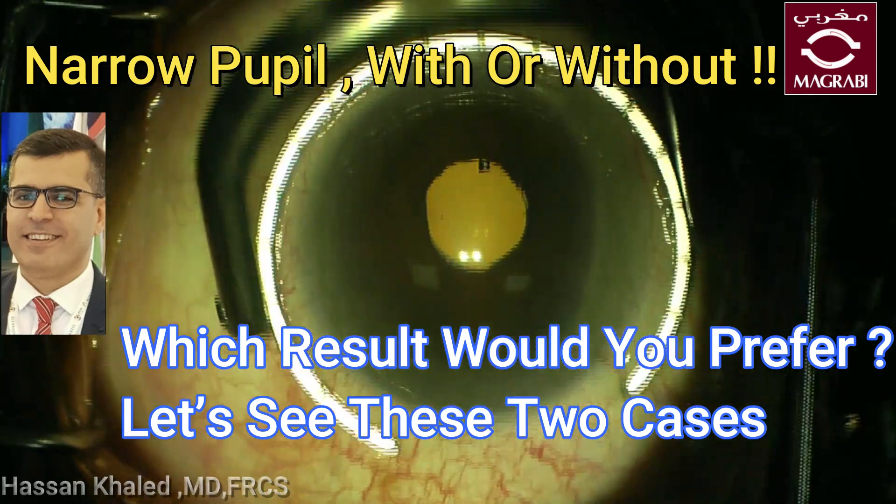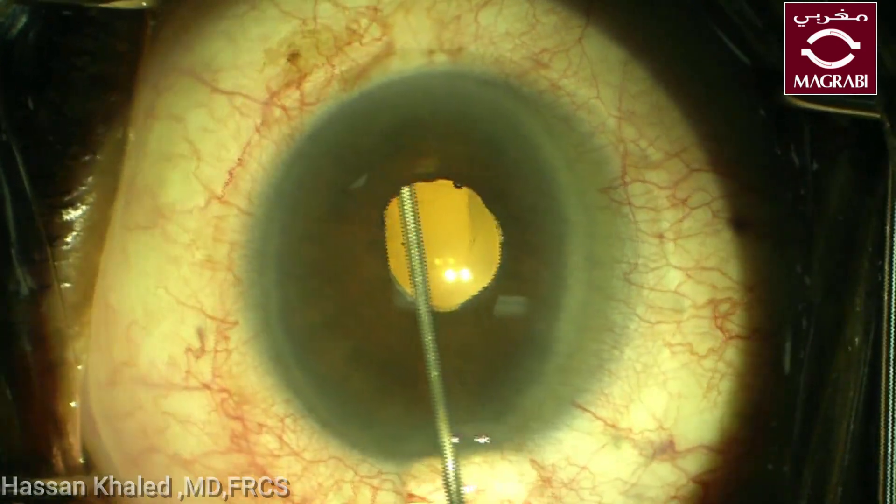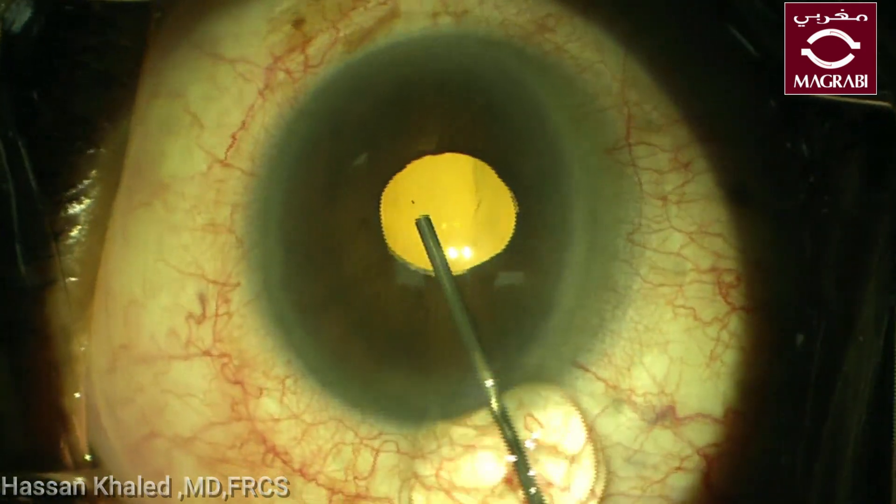Narrow pupil with or without — here I am going to present two cases of phacoemulsification with narrow pupil.